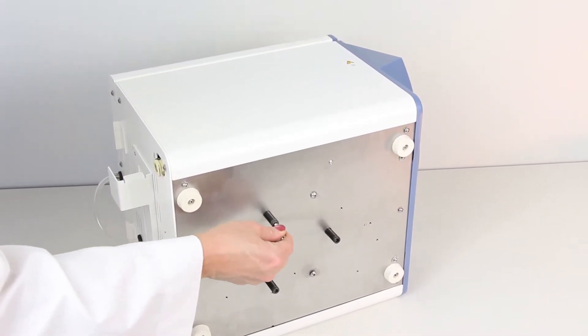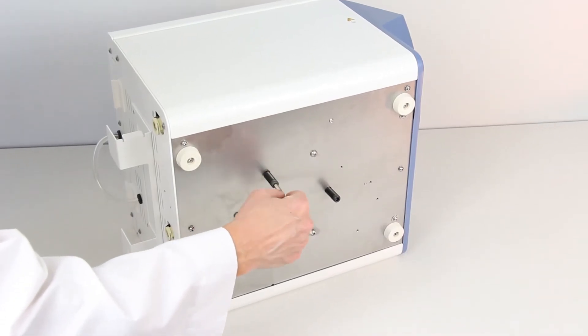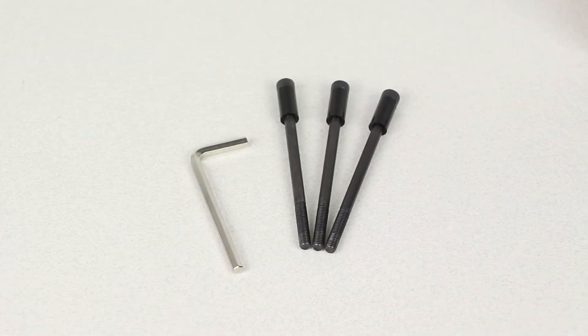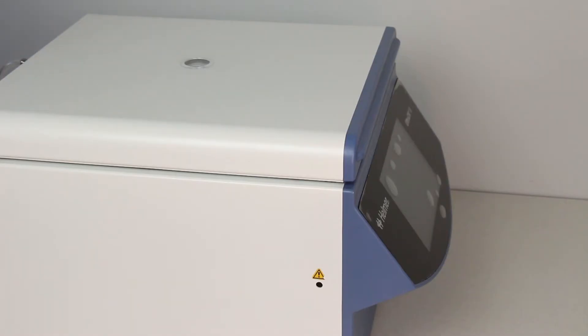Place the Ultra CW2 in a position that allows access to the bottom of the unit in order to remove the transport bolts. Use the Allen wrench included in the accessory bag to remove the bolts. After the transport bolts have been removed, use the emergency release to open the lid and remove the foam packaging material from the top of the rotor.